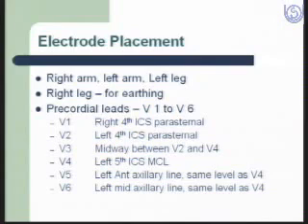Now we have conventionally a 12 lead ECG, in which we place the electrodes, one on the right arm, another on the left arm, and one on the left leg, which are all the active electrodes. Another electrode is put on the right leg, and that is for proper earthing and does not take part in active recording of potentials. And then apart from this there are 6 electrodes which are placed on the chest, and they are known as the precordial electrodes. They are from V1 to V6.